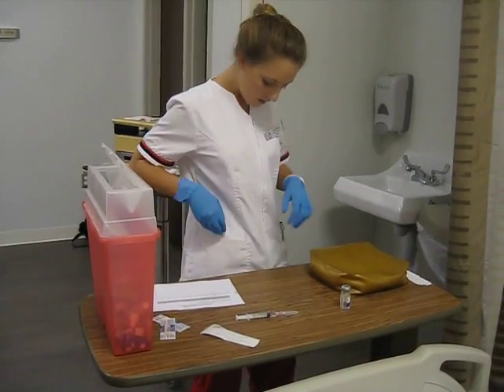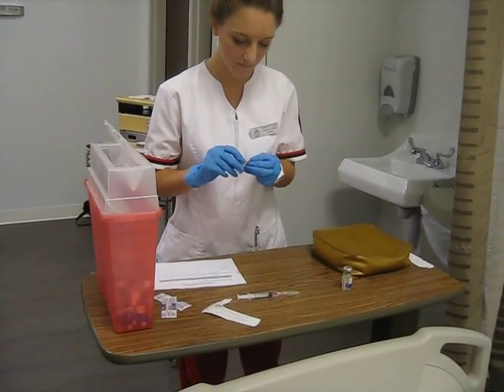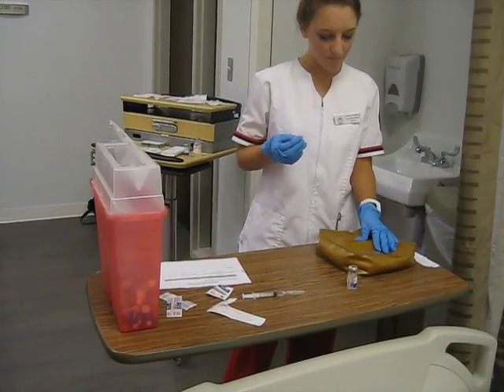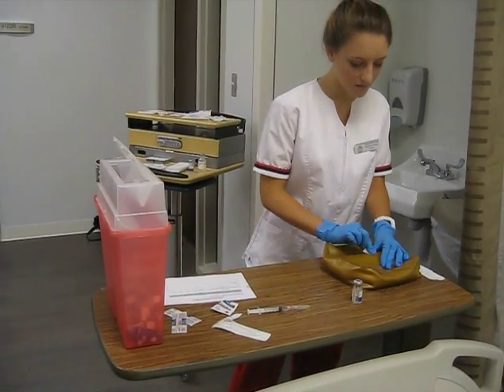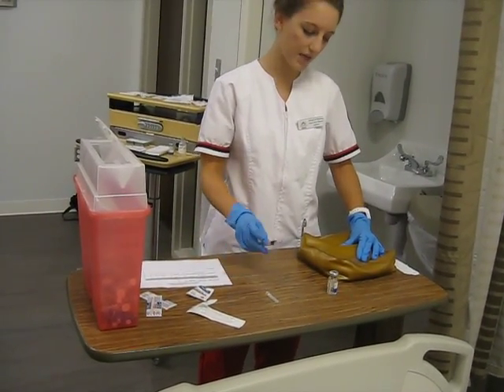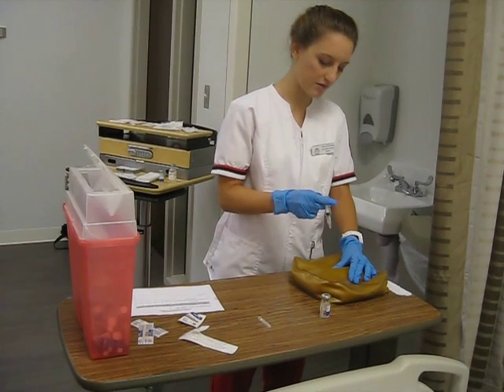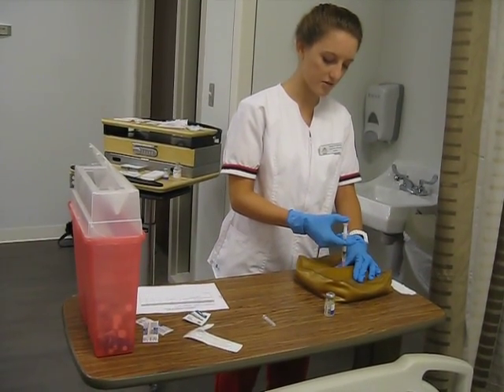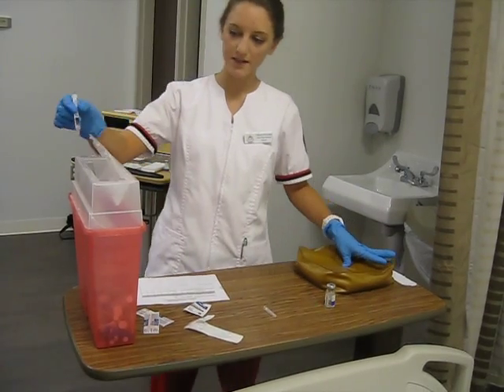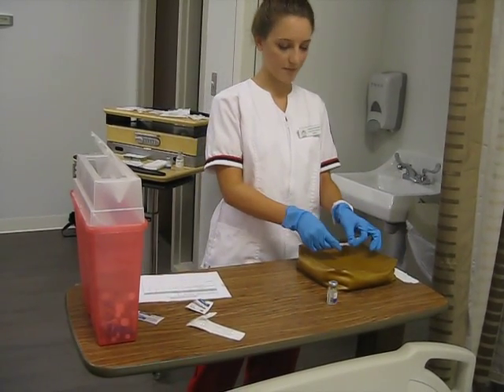Now for the subcutaneous, I again will need to clean the site. I'm going to locate it at the back of the arms — I'm going to go ahead and pinch up a little, clean, and let it dry. Since this is subcutaneous, I could go in at either a 90 degree or 45 degree angle. For this patient, I will go in at a 90 degree angle. I would insert my solution and pull out, apply pressure. I'm going to put my needle into the sharps container without recapping. And I could place a band-aid if the patient needed it.